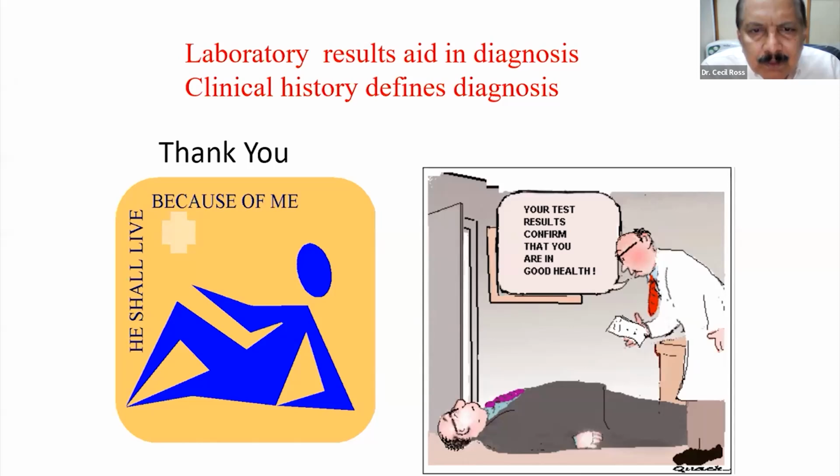Is a manufactured control better, or the mean of a population sample? I'm not too sure whether you will get a manufactured control, because control is what you do in your laboratory. What we normally do in our laboratories is have our own laboratory controls: a commercial control value and a normal control, and then you also find out in your laboratory what your control is.